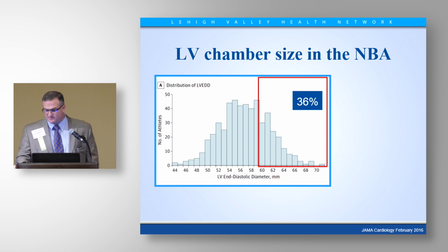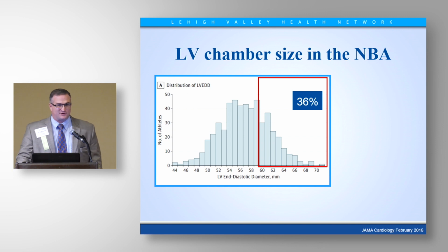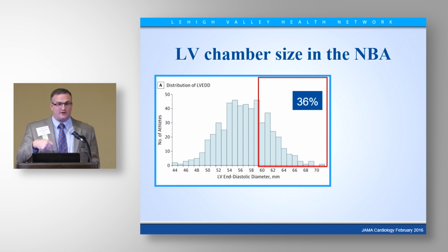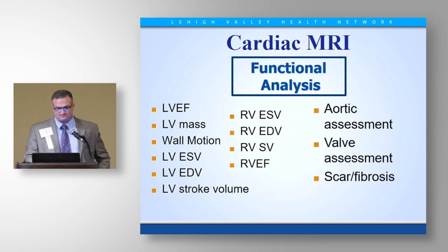One of the folks who reads near us routinely calls severe biventricular dilation for 58 and 60 millimeter ventricles. It really gets complicated down the line because I'm undoing a written report. So making sure that you're on top of your referrals and talking to the radiologist or the cardiologist who's interpreting these, because the numbers matter.